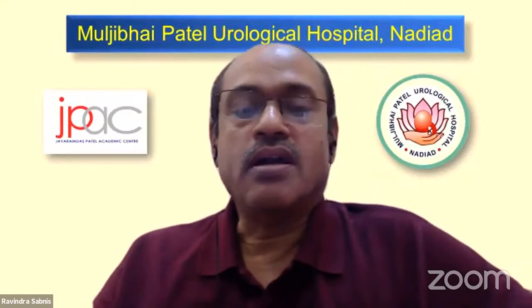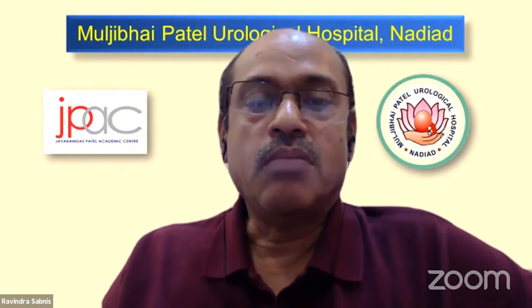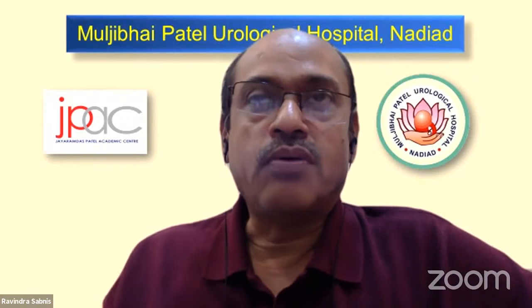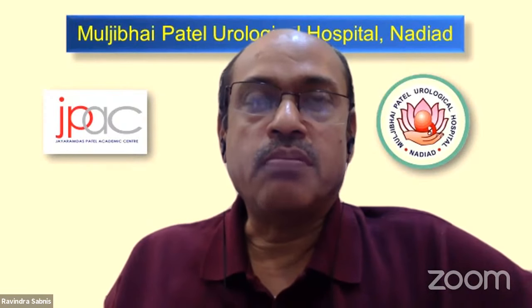Actually, Dr. Sabnis has done the comparison between the shock pulse and the trilogy. But what we thought was that we should keep the location of the stone the same. Sabnis, what was it? Yeah, I think we did a study, and in those cases we did not use the conventional PCNL, but we compared shock pulse and the trilogy with the mini PCNL. And what we found is that both energies are quite superior. They are almost the same, not much difference.